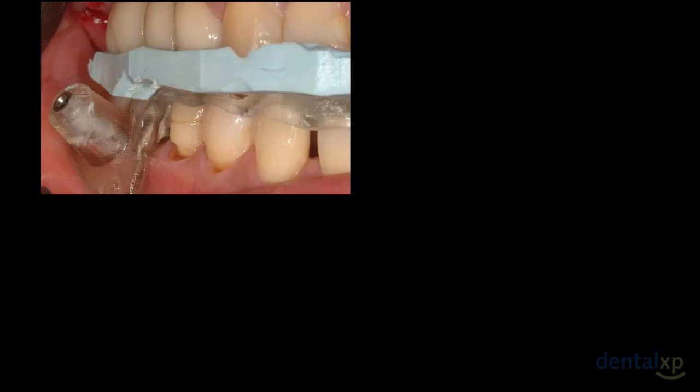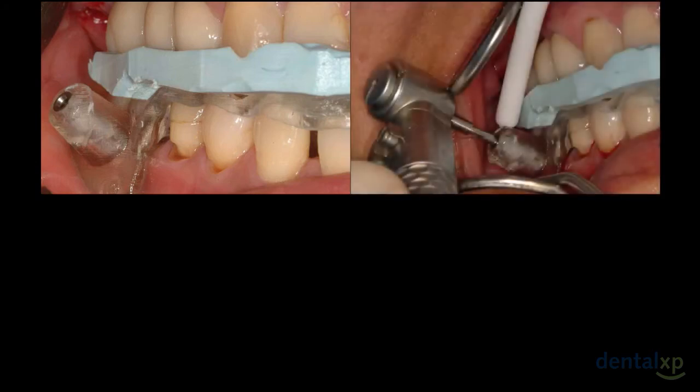Once we get back the surgical template, we can place it into the patient's mouth using an index to make sure that we've secured the position of the surgical template in the same position as the radiographic template that was used during the cone beam CT images that captured that data. An anchor pin is placed so that we can fixate the surgical template, because remember, we do not want to remove it once it is placed.